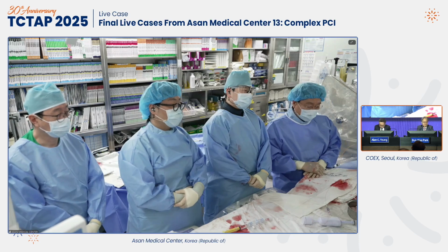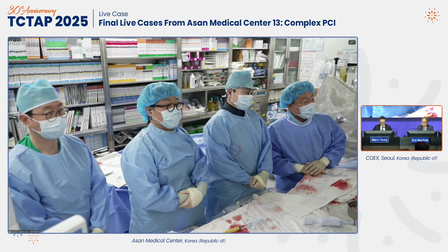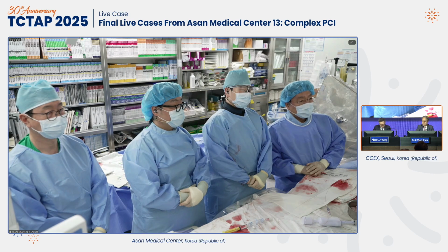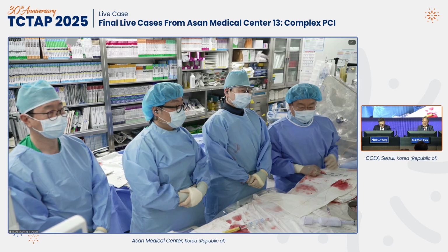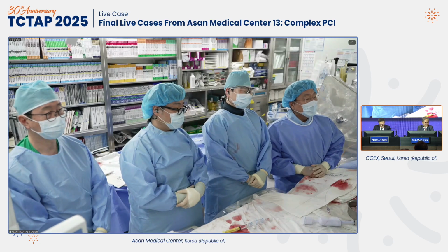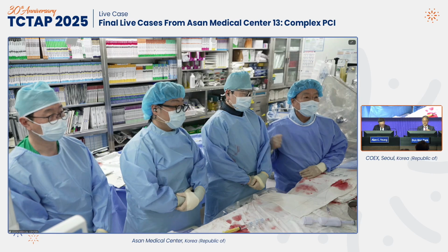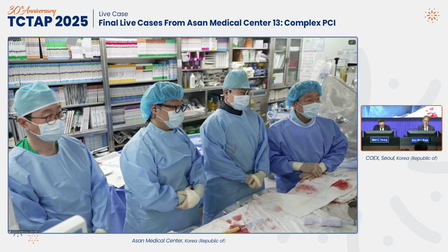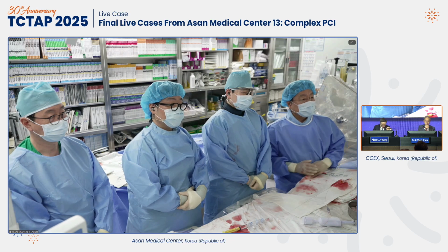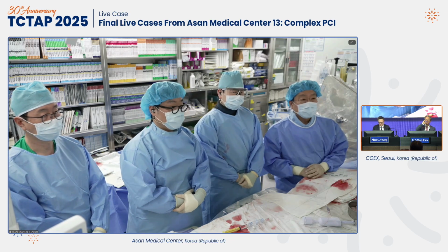This is a live case, the last complex PCI session. However, what I would like to show is not too complex, but you can take some lessons. I'd like to introduce Kim Jinhyun, our junior staff, and senior fellow Seung-Jung. Anyway, we're going to start case 4. So you present the data.